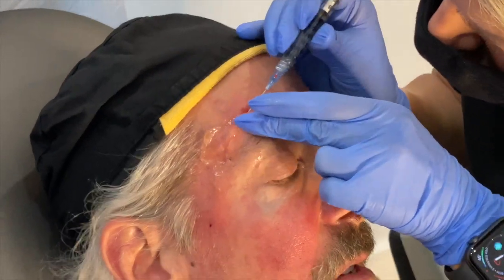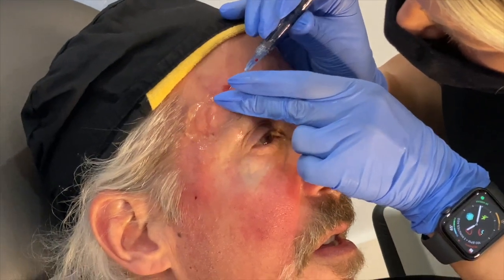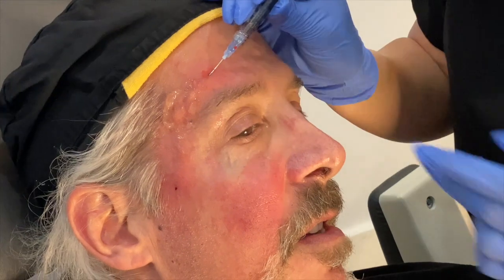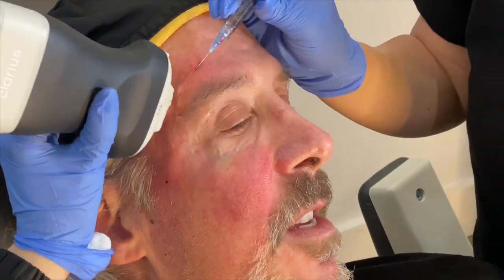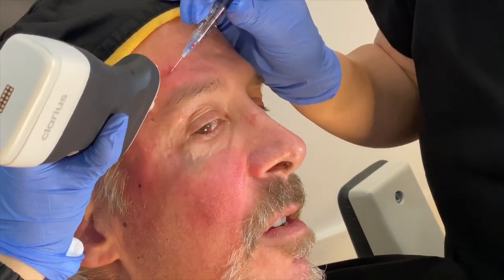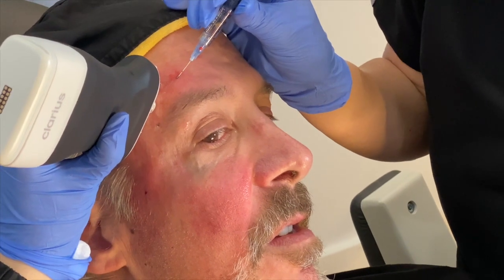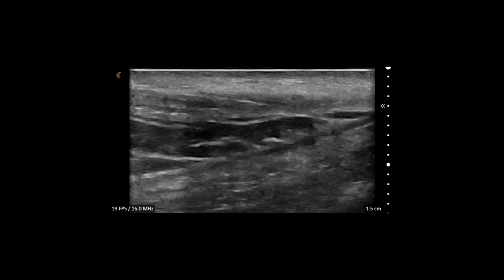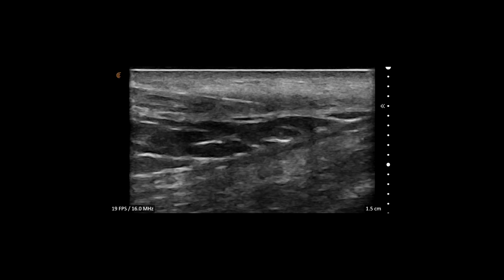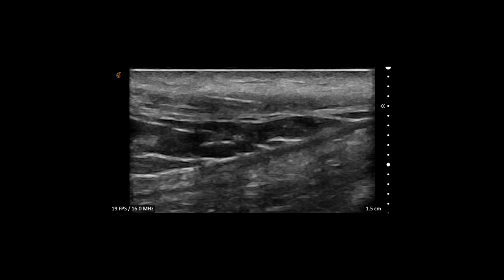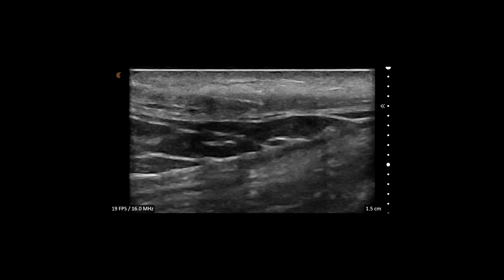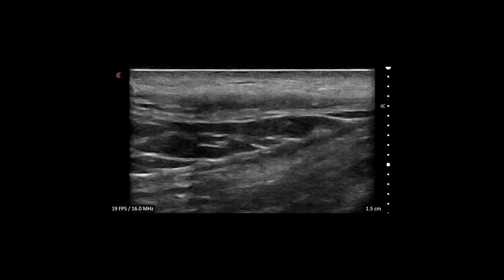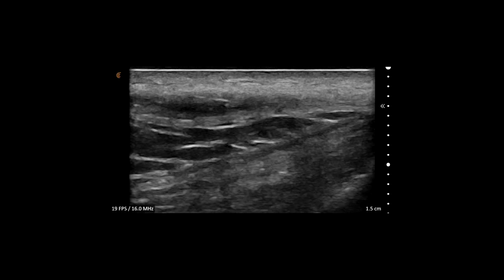This is a different approach to that same plane. If you go down to the periosteum, the periosteum is contiguous with the deep temporal fascia. So I'm entering the temple in the interfacial plane from a superior direction. I'm confirming placement again using the Clarius ultrasound. You can see the cannula coming in from the upper left side and entering in that interfacial space. It is injecting along the deep temporal fascia and you can see the anechoic material being injected in this space.